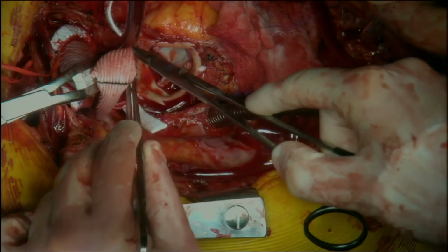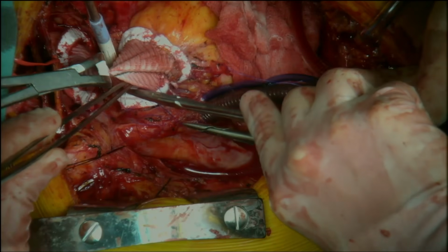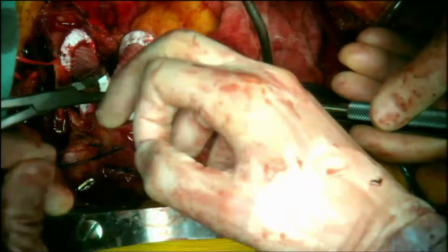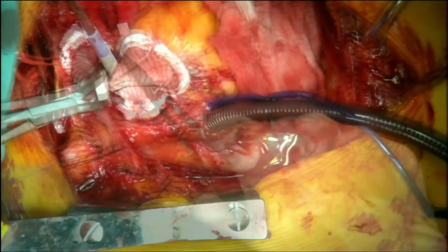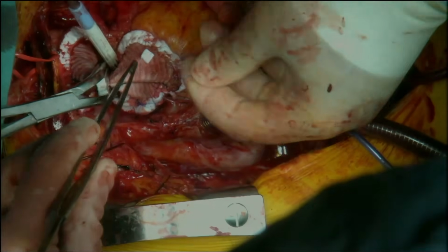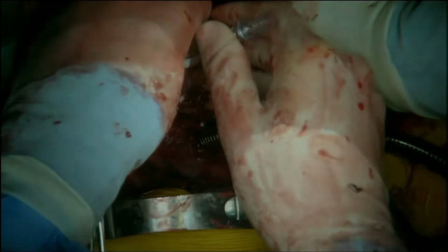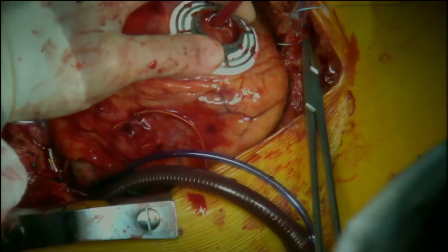The conduit is anastomosed using a running 4-0 Prolene. Sutures are placed for the aortic root vent to facilitate the de-airing. The conduit is unclamped and flow is restored.